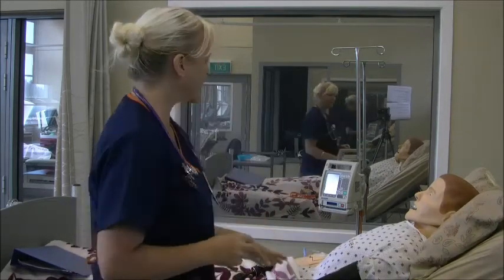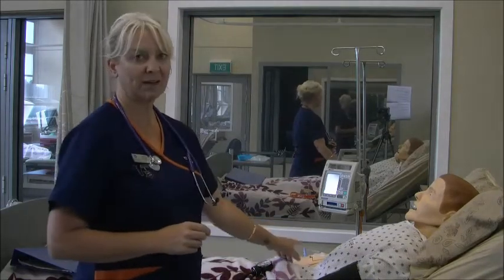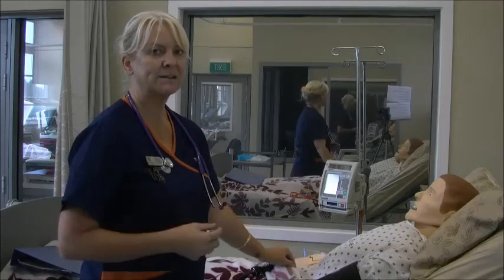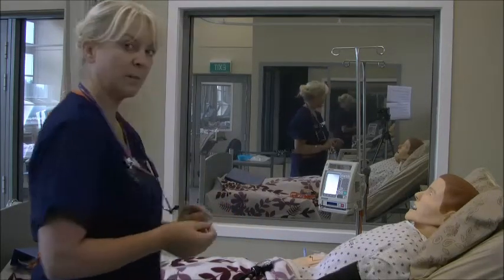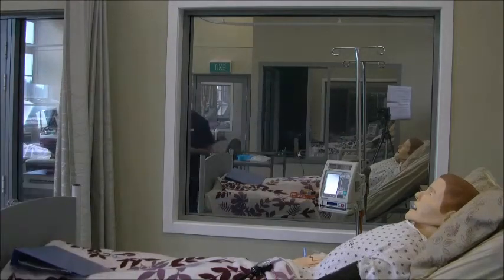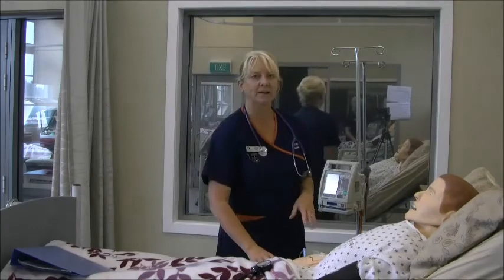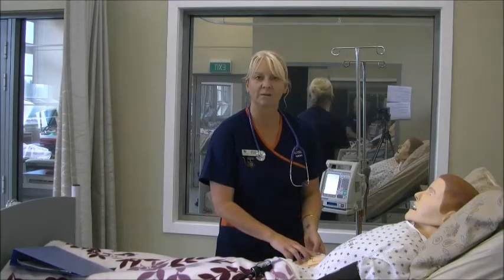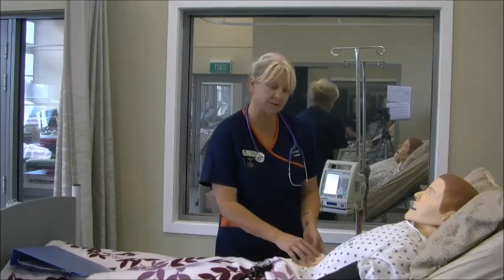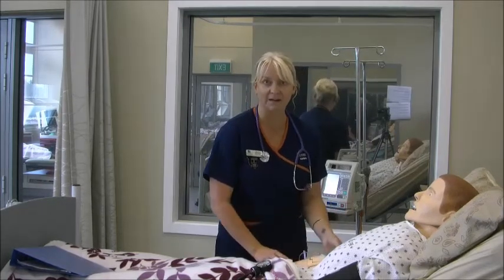I'm quite happy that he is safe in the bed, and I can see that he has an IV cannula in situ. One of the assessments I'll also make is his VIP score. So I'll just pop round and have a look at that. I need to know that his IV is able to be used, so I'd ask the tutor when the cannula was put in. So she'll tell me that it's just gone in and it has been flushed, so that it should be ready to be connected.